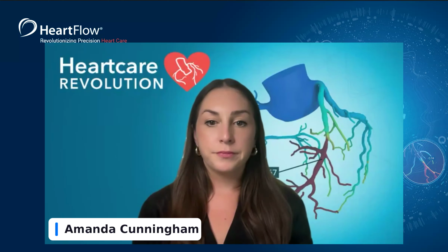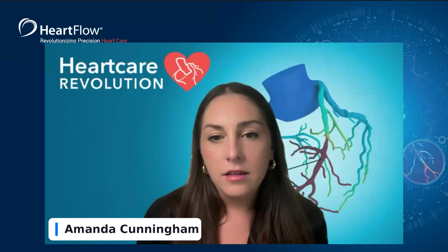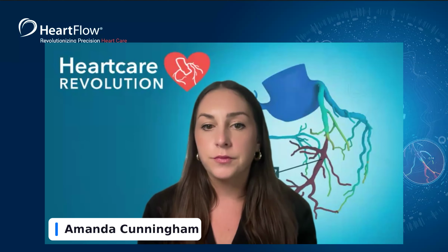That's perfect. So hopefully that answers your question. And Amanda, are you reading that the same way, or are you reading that differently? Yeah, that is how I read it. If it's a retrospective, they can always recon it. And if it falls out of that range, it's going to be a little bit noisier. Maybe the image quality won't be as good as it could be in the full dose range.